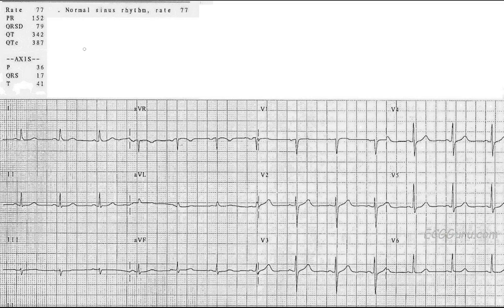Another thing that's normal about the ECG is the PR interval. I can look at the PR interval where the machine has read it and it says 152 milliseconds. If your machine measures in seconds, the reading will be .152. A normal PR interval is .12 to .20 seconds, which is 3 to 5 little blocks. It's usually easy to just look at the PR interval and see if it contains more than one big block from beginning to end. Looking from the beginning of the P wave to the beginning of the QRS in AVR, it doesn't go over one big block — so this PR interval is normal.